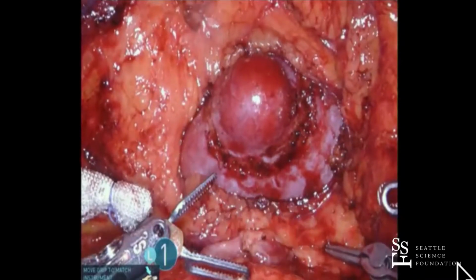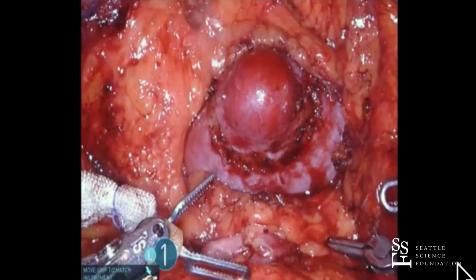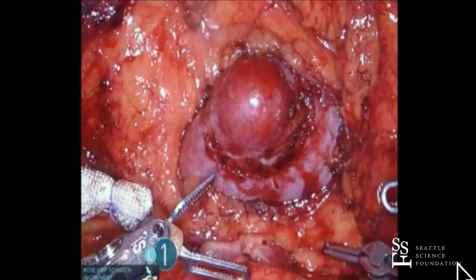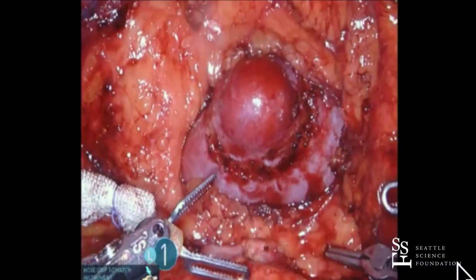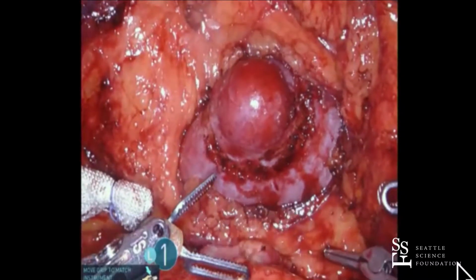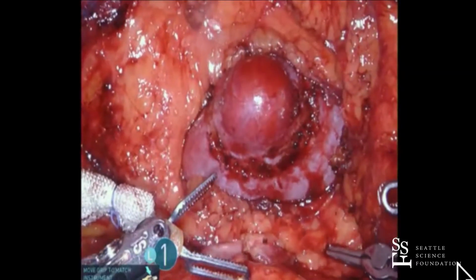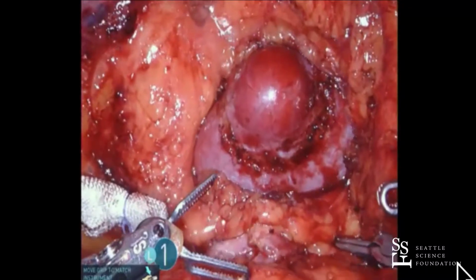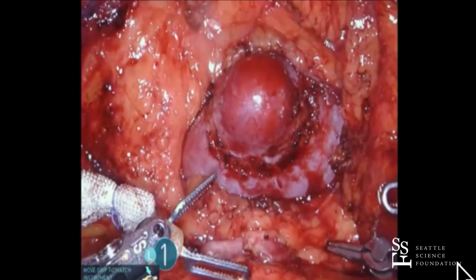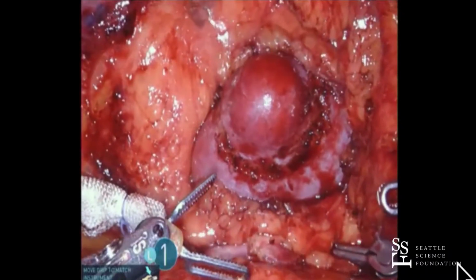Now, it depends on the size of the defect. I do individual vessels and collecting system with a 4-0 Vicryl. I run the base with kind of a running monofilament, and the purpose of that is not so much to get vessels, but to decrease the dead space, to bring the base together so you don't have this dead space. And then I do the outer layer with kind of a classic sliding clip renorrhaphy with 2-0 Vicryl, and then Hem-o-lok on each side.